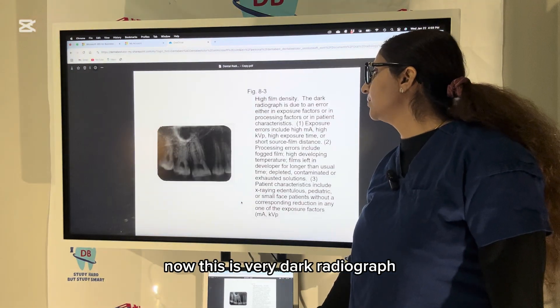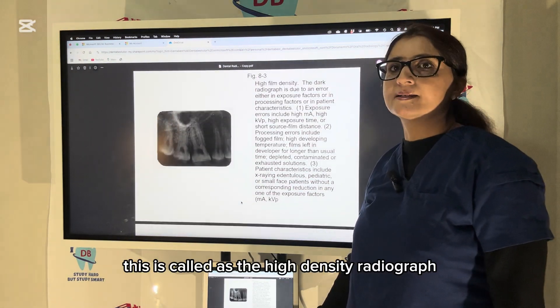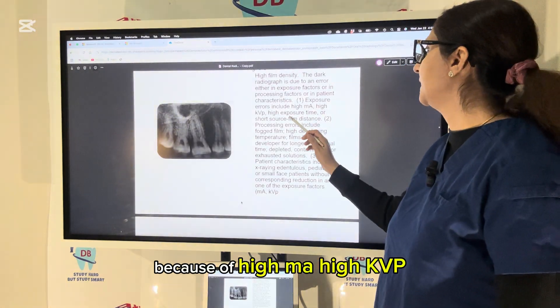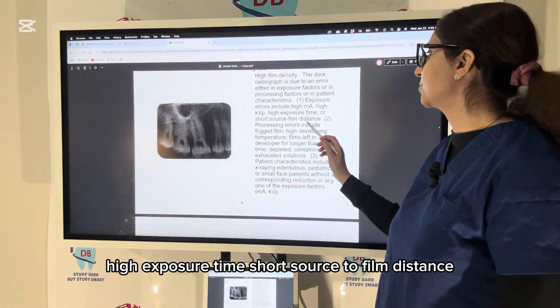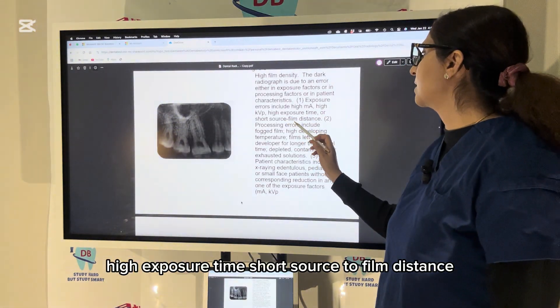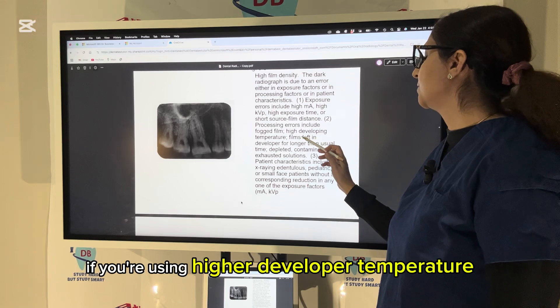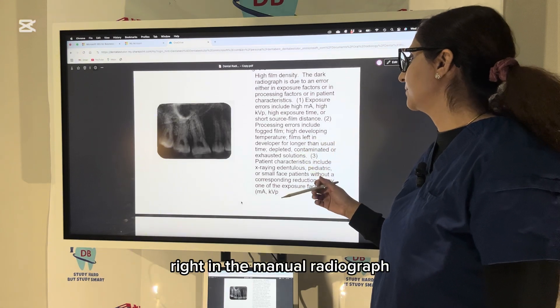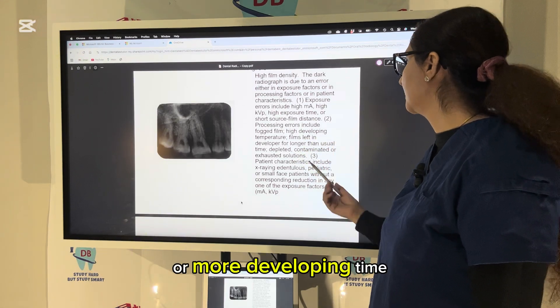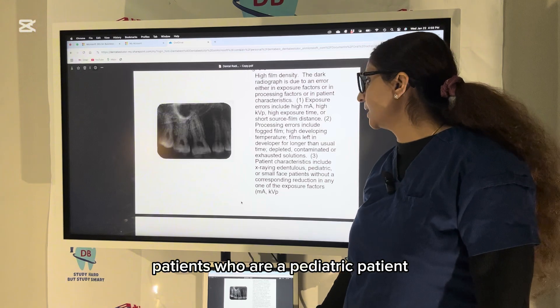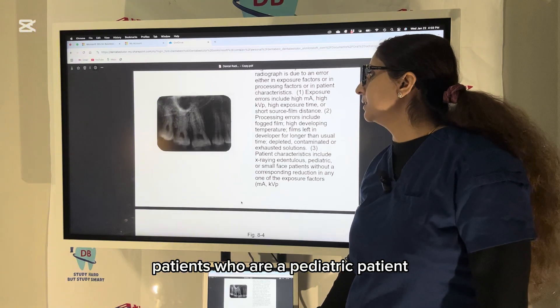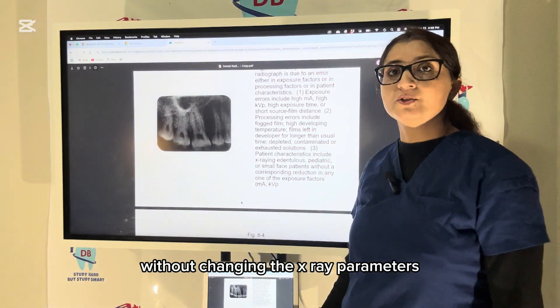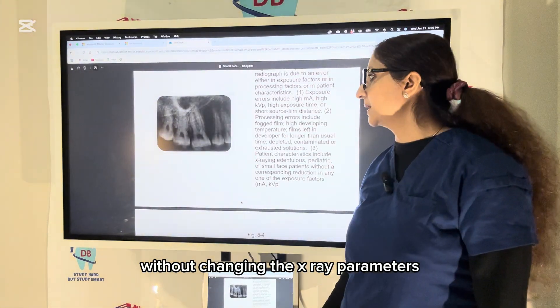This is a very dark radiograph — called a high-density radiograph — caused by high mA, high kVp, high exposure time, short source-to-film distance, higher developer temperature in manual radiography, or more developing time. For pediatric patients, taking a radiograph without changing the X-ray parameters can also produce a dark radiograph.